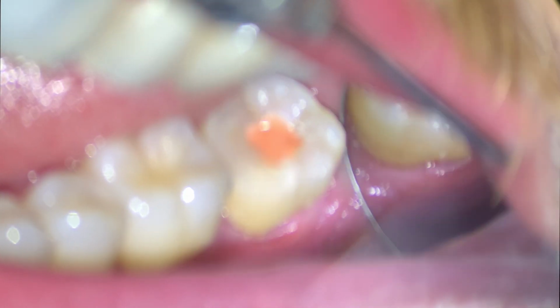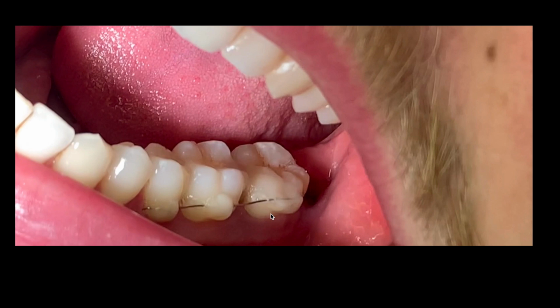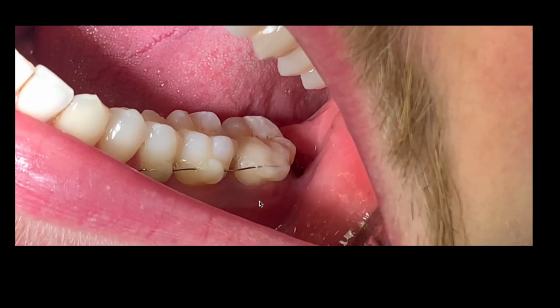So this is the case right before we did the root canal, approximately 6 months ago. I'm sorry, I'm skipping back. So you can see we've got some great healing. This is about 2 weeks after the procedure had happened. You can see we're getting healing of the socket. Our gingiva looks great, and we don't have our access hole. So the patient's happy and we're good.